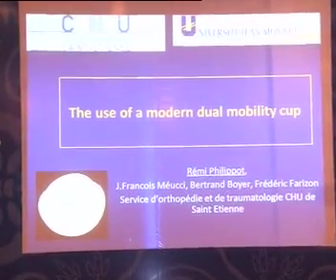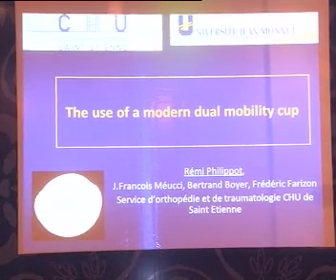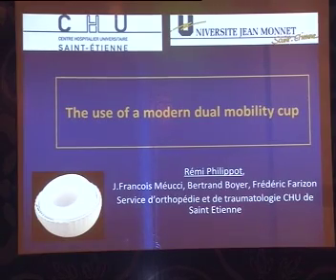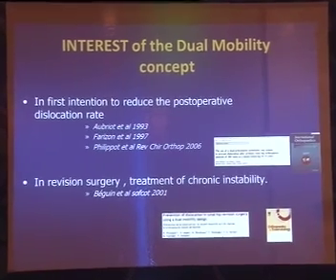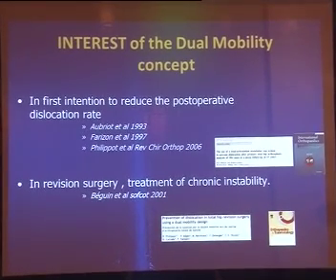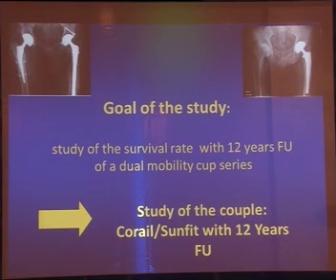So I'll speak about a French concept. It's not a trauma subject, but it concerns a specific French concept about total hip arthroplasty. The dual mobility concept was invented in France in 1974, and this concept has already proved its interest for reducing dislocation rate in first intention, but also in revision for the treatment of prosthetic instability.